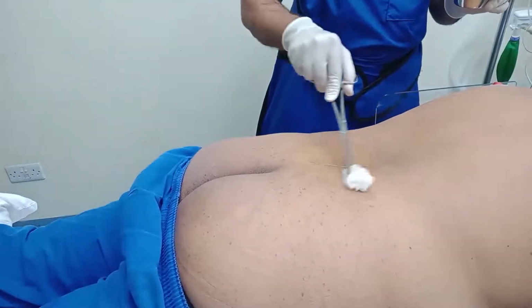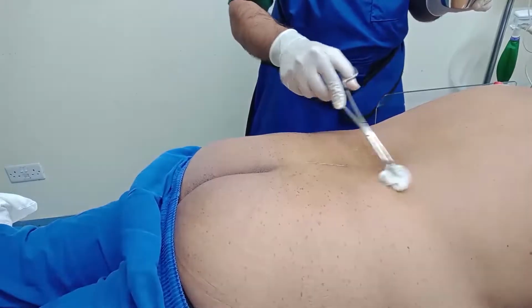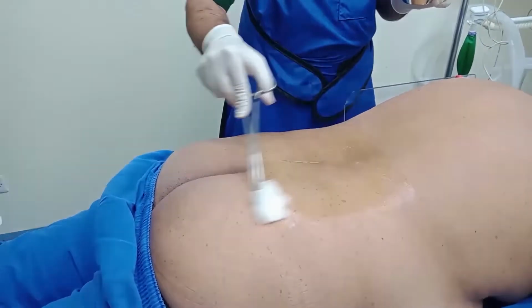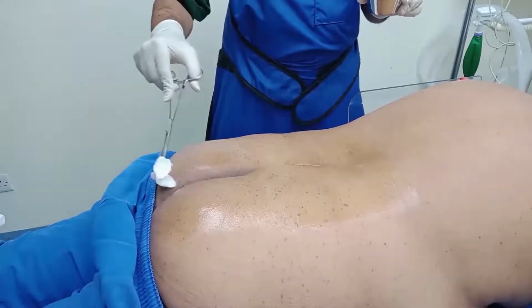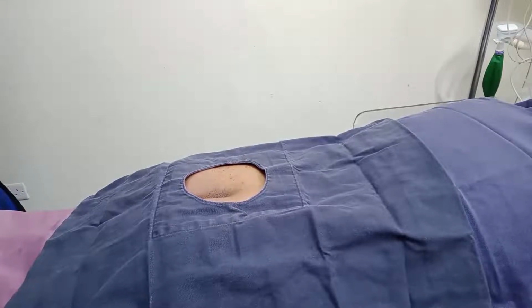Skin preparation is extremely important to ensure complete asepsis of the procedure. From the mid-thigh to the upper part of the back, the chlorhexidine solution is taken in the pot and scrubbed onto the relevant area. What's extremely important is that the liquid does not spill into the perineal region because it will be very irritating for the patient and make them uncomfortable. The patient is draped in sterile drapes covering the entire length of the patient except for the area in which the intervention is to be done.